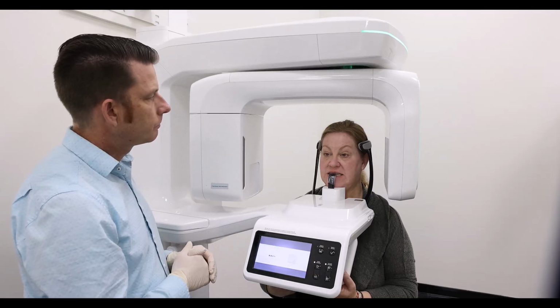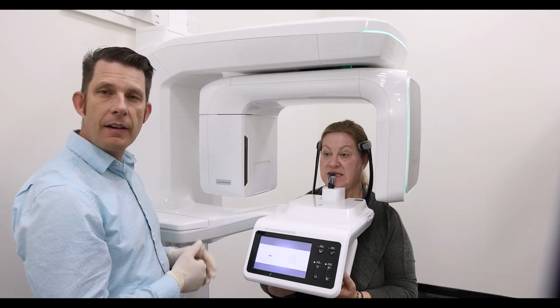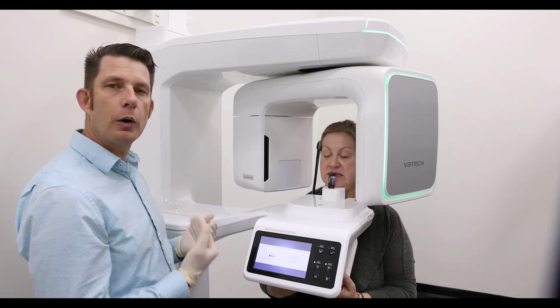The system is moving into capturing position. Please wait. The device, as you can hear, is going to give the patient some instructions. I'm going to go ahead and step out of the room, and we're going to go ahead and take our image.